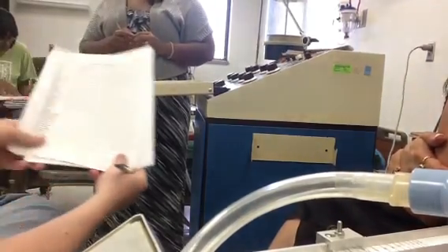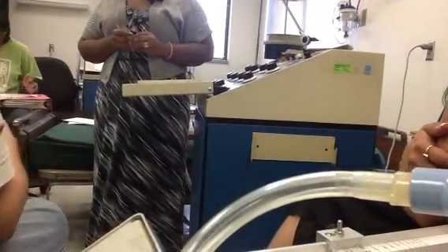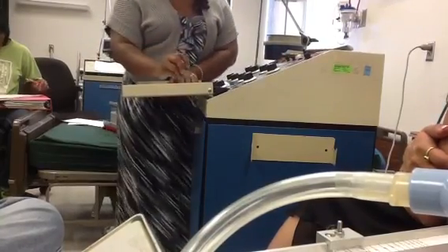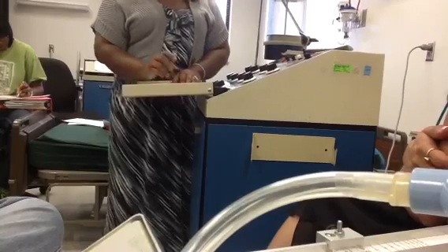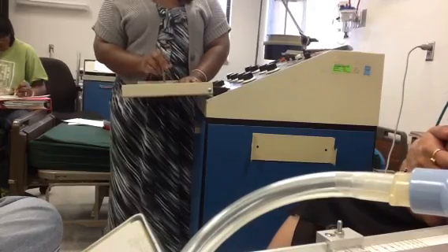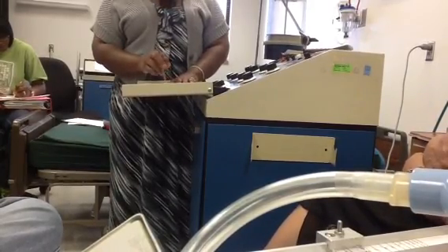All right, y'all got that? And then the last section, like she said, are your alarms. So we did date, time, mode. Then the rate that you were ordered to set, which was 16. Tidal volume that you were ordered to set, 550.